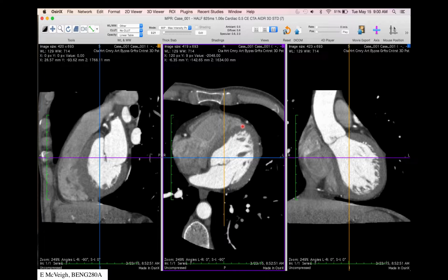And with a 3D image analysis program, in this case, this one's called Osirix or Horos, it's free. You can load that volume data in and image or probe that data from multiple directions. So it's essentially isotropic 3D data, so you can look at any given slice through the patient retrospectively.